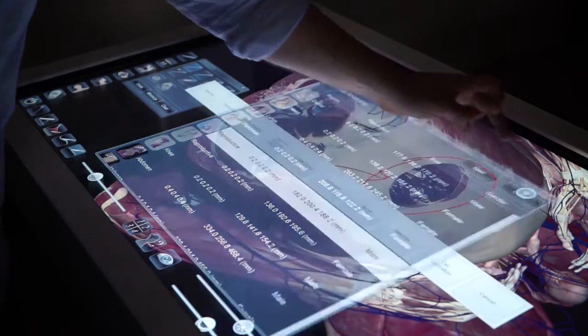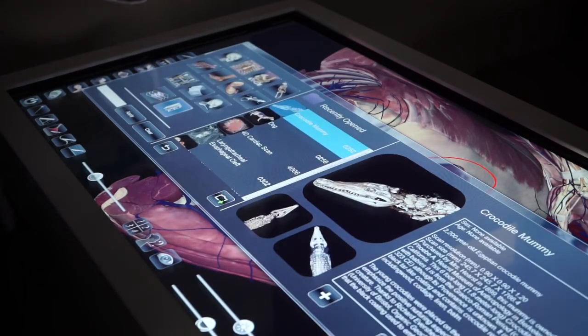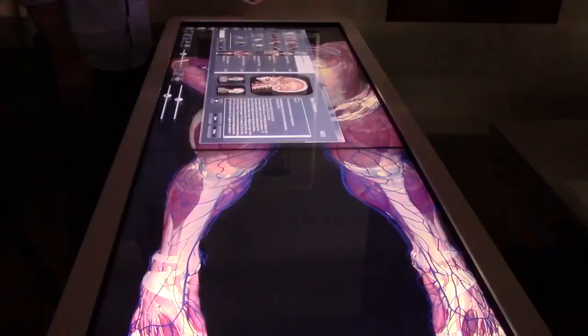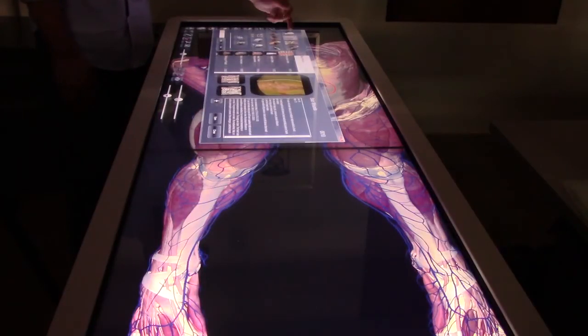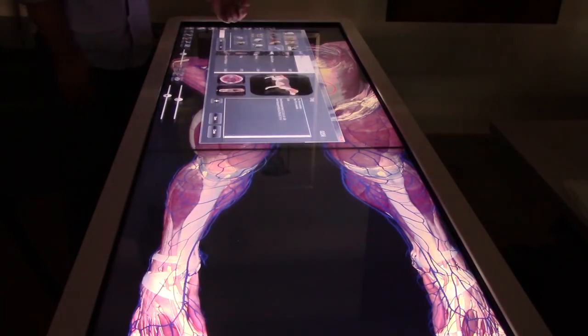I can choose to close that, go back to the menu, and select Image Library. This includes a repository of hundreds of images compiled by the Anatomage group that are sectioned in different folders indicating different areas of the body.